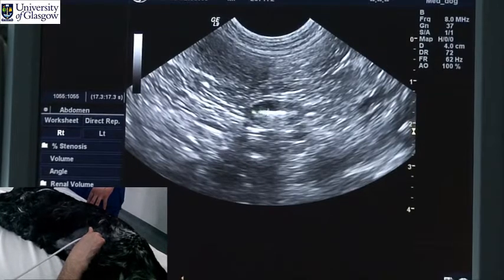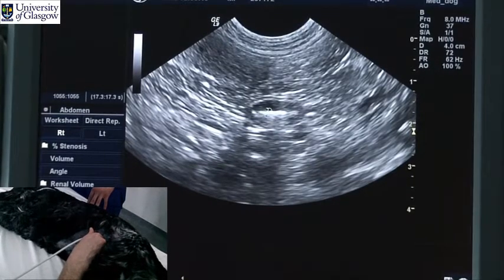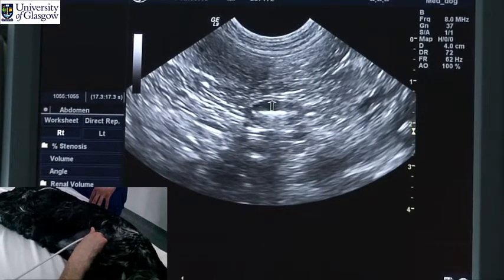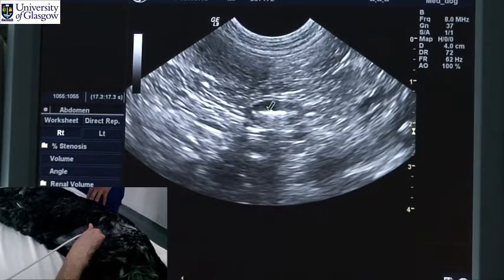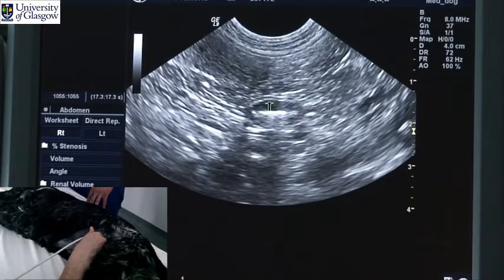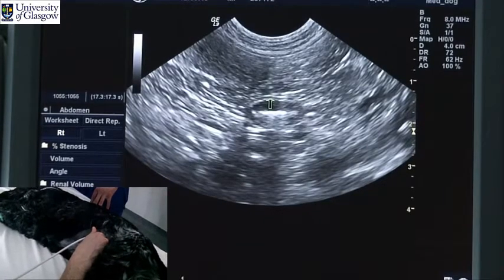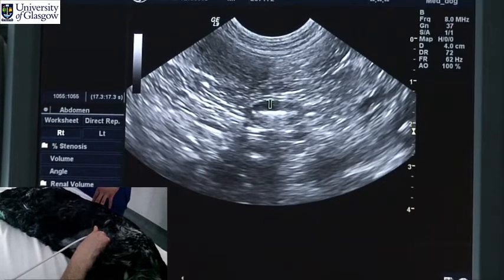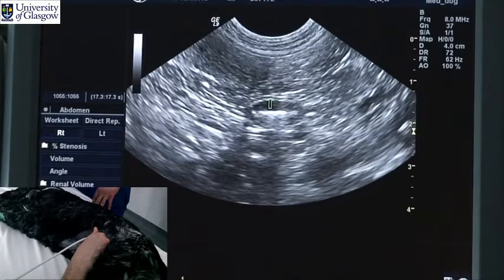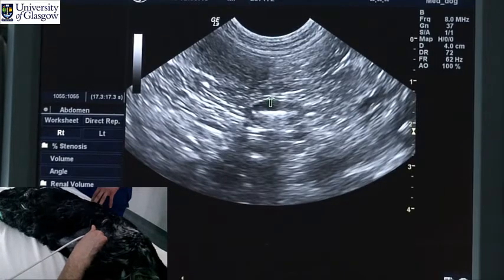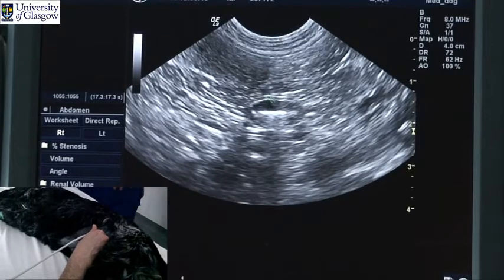In the centre we have a hypoechoic lumen, a thick dark layer of mucosa, a thin bright layer of submucosa, a thin dark layer of muscularis outside that, and then a thin bright layer of serosa on the outside.